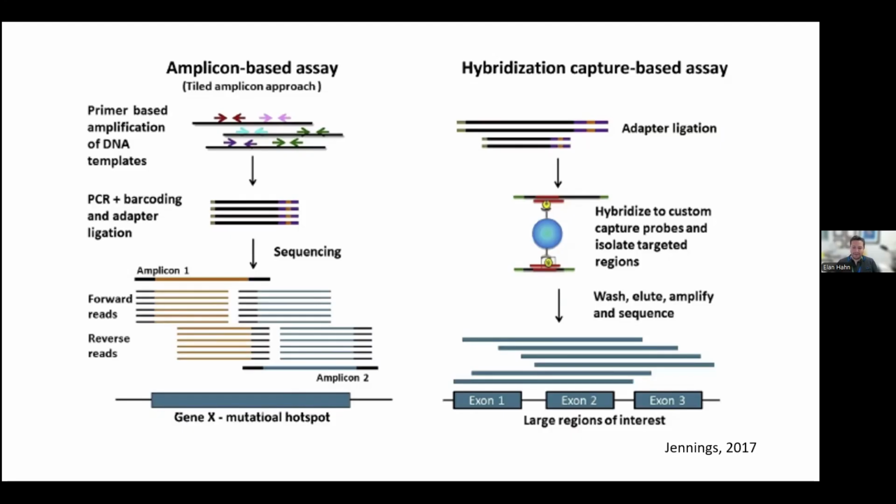And we'll get into that as well. The sequencing reads from these molecules will have unique start and stop coordinates, so they're not all going to be identical, like amplicon-based assays. And they'll be aligned to the reference and allow identification and removal of PCR duplicates, where it looks like maybe we amplified the same captured fragment more than once. In the bioinformatic aspect of the analysis, that's something that can be filtered out.